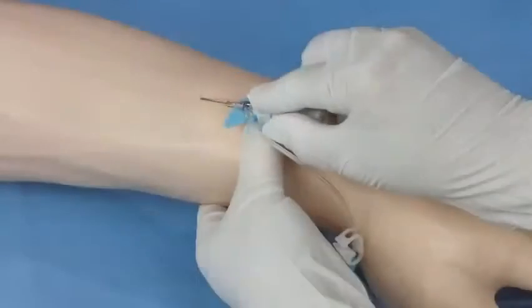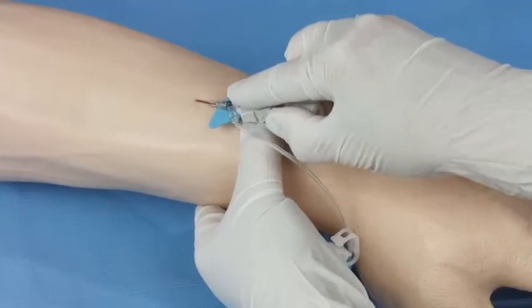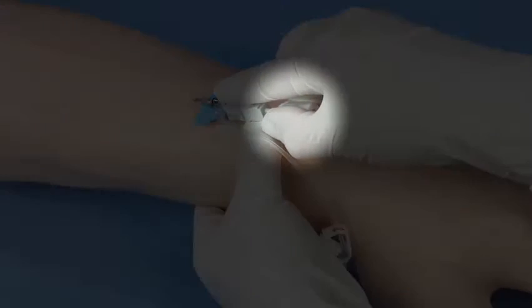Using the pad of your index finger behind the gray push tab, push the catheter forward into the vessel. Do not pull back on the white finger grips while pushing the catheter forward.